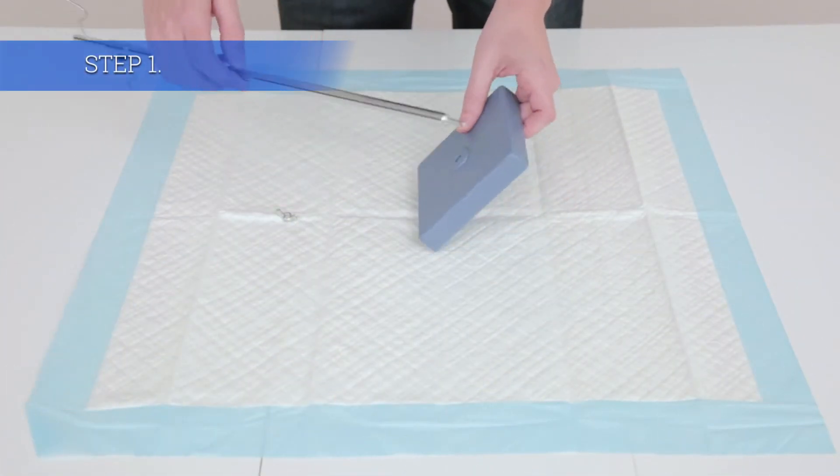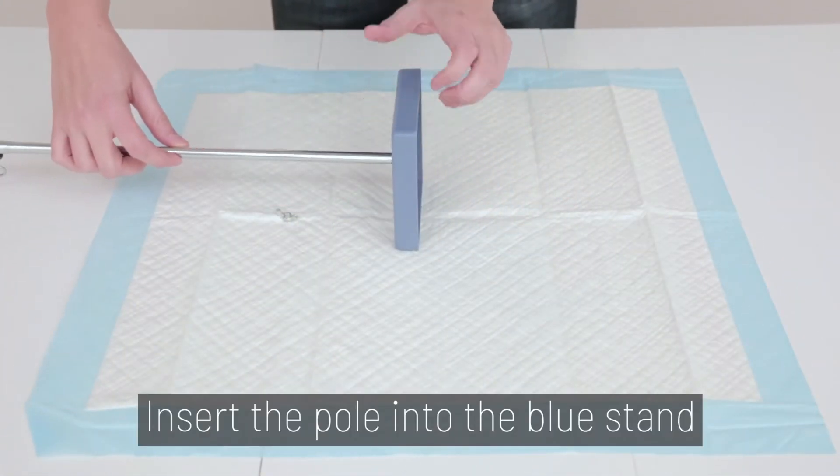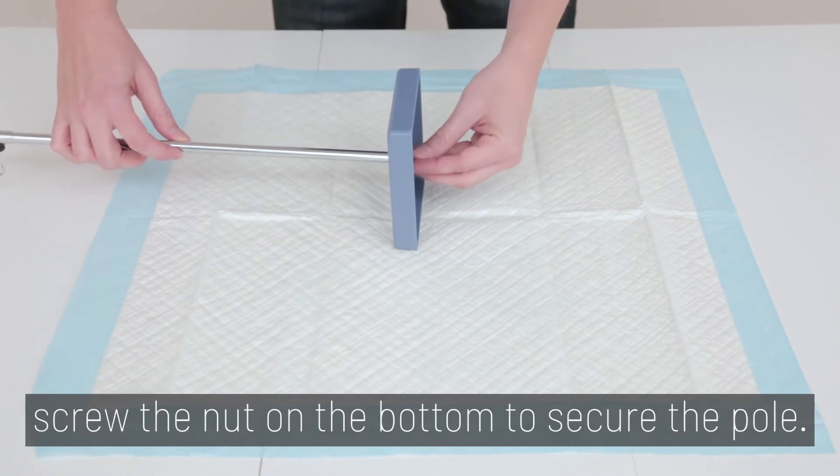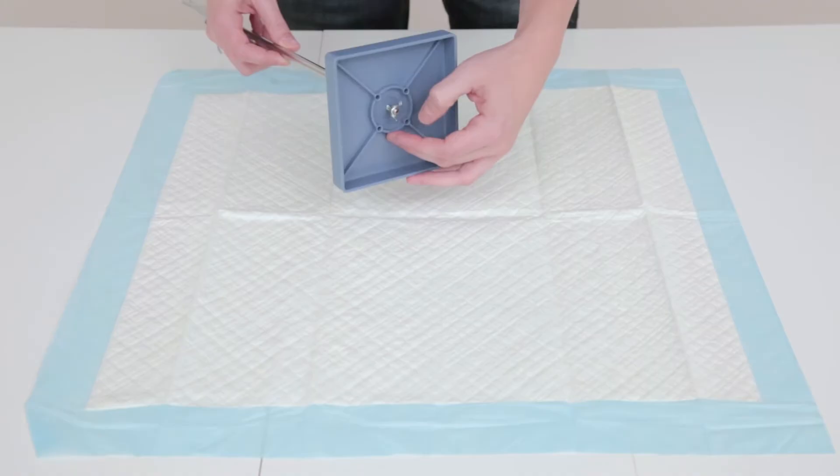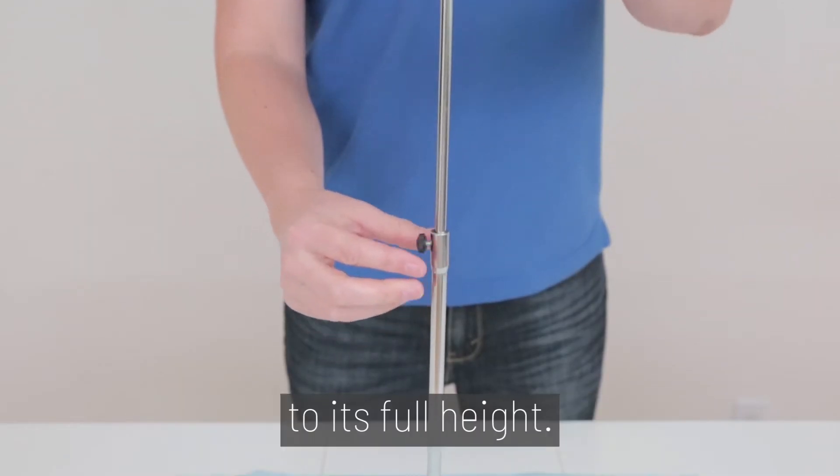Let's dive in. Step 1. Insert the pole into the blue stand. Screw the nut on the bottom to secure the pole. Make sure the pole is extended to its full height.